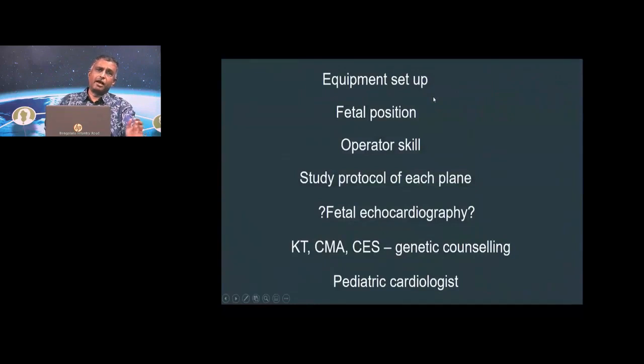So equipment setup is very important. Fetal position is extremely important, and this can be oftentimes trying. You have to wait until you get what you want. And remember, parents are willing to come for days on end to get their baby's heart checked, right? Operator skill is extremely important. Knowing those planes, what is to be produced, is step one. Producing those planes is step two. The most important thing is running your checklist into each of these planes. If you begin to do that, fetal cardiology becomes mathematics, and your pickup becomes manifold.